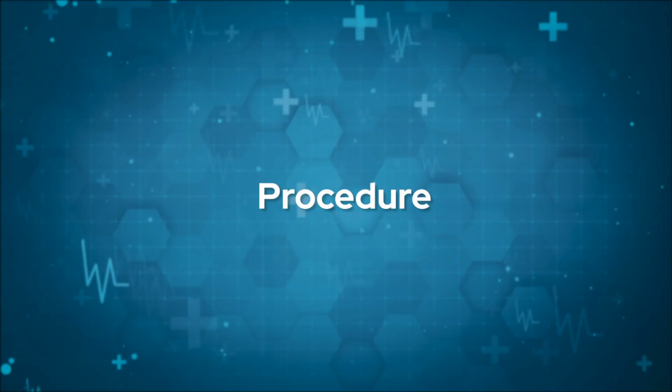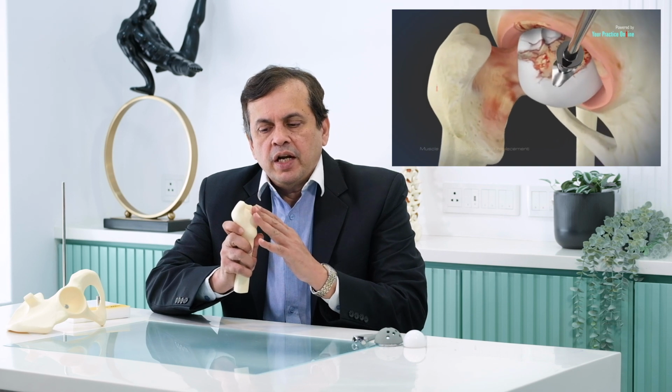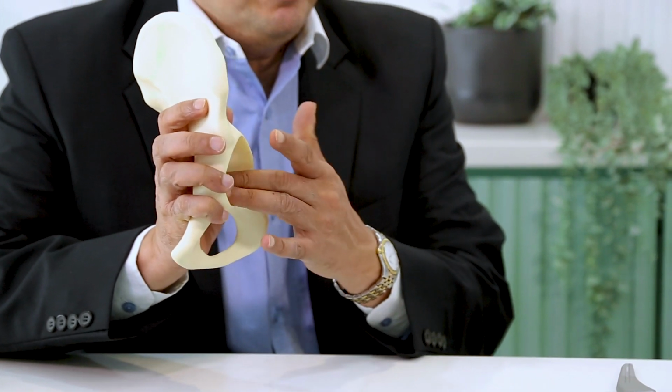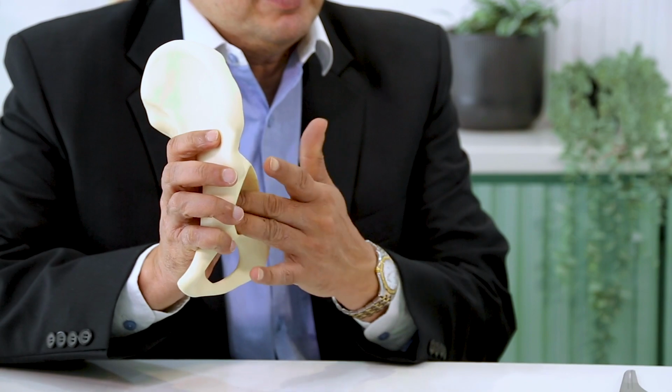Now let's know more about the procedure of total hip replacement. This procedure is done in two parts. In first part, the damaged surface of the femur bone, which is the top of the thigh bone, is removed and the surface is prepared on the top. The second portion involves preparation of the cup of the joint, in which the pelvic bone, you see the cup here, which is reamed, and appropriate soft surface is created.